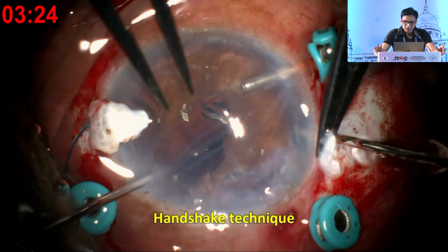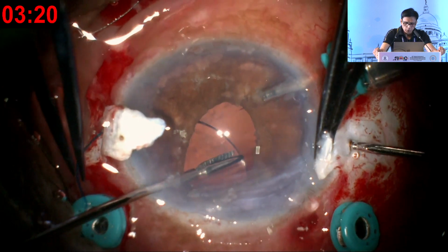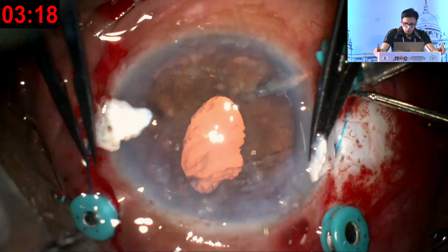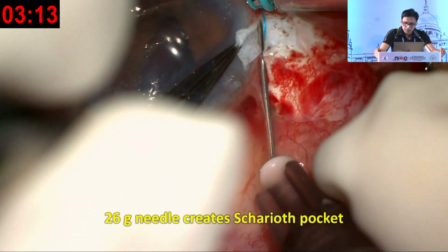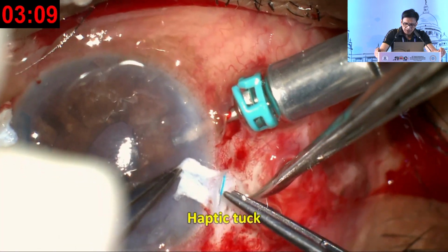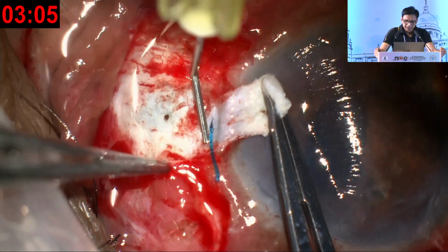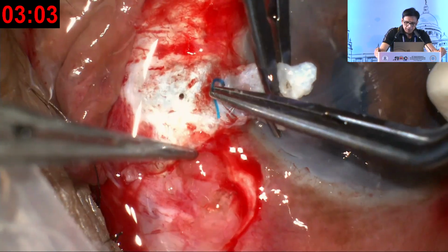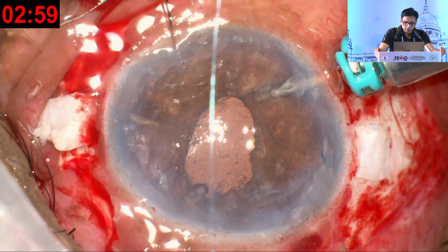Again, catch it anywhere. Remember one thing, you need two forceps always when you're doing a glued IOL technique, because you will use it sometime or the other. Now take the 26 gauge needle, create the Scharioth pocket and tuck these haptics inside. Once both haptics are tucked, then you are very comfortably placed, because now you have to solve the endothelial decompensation.